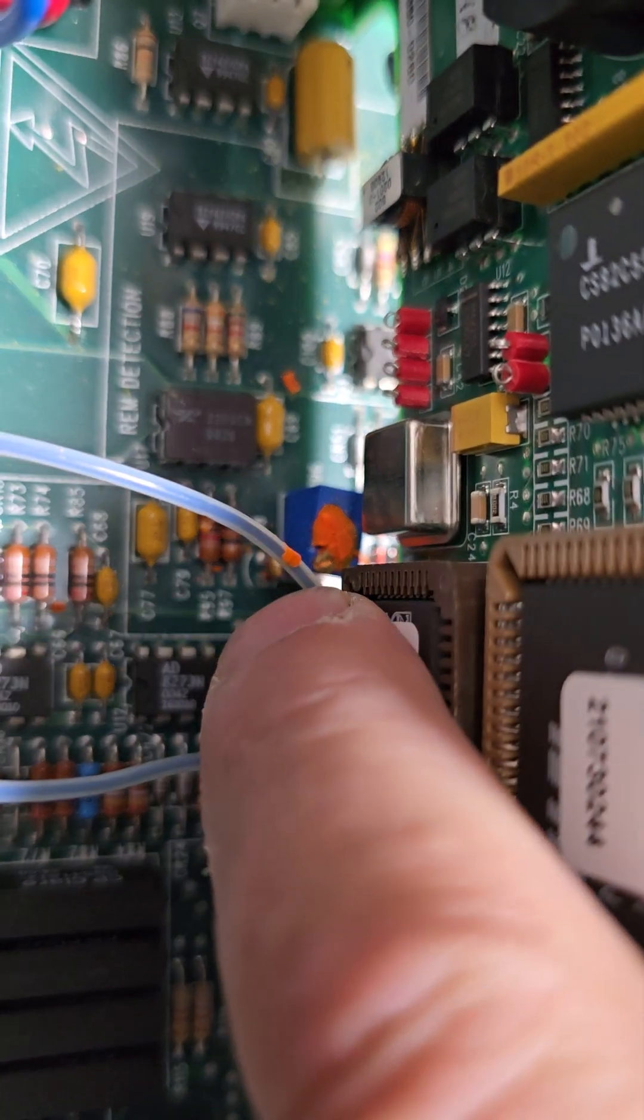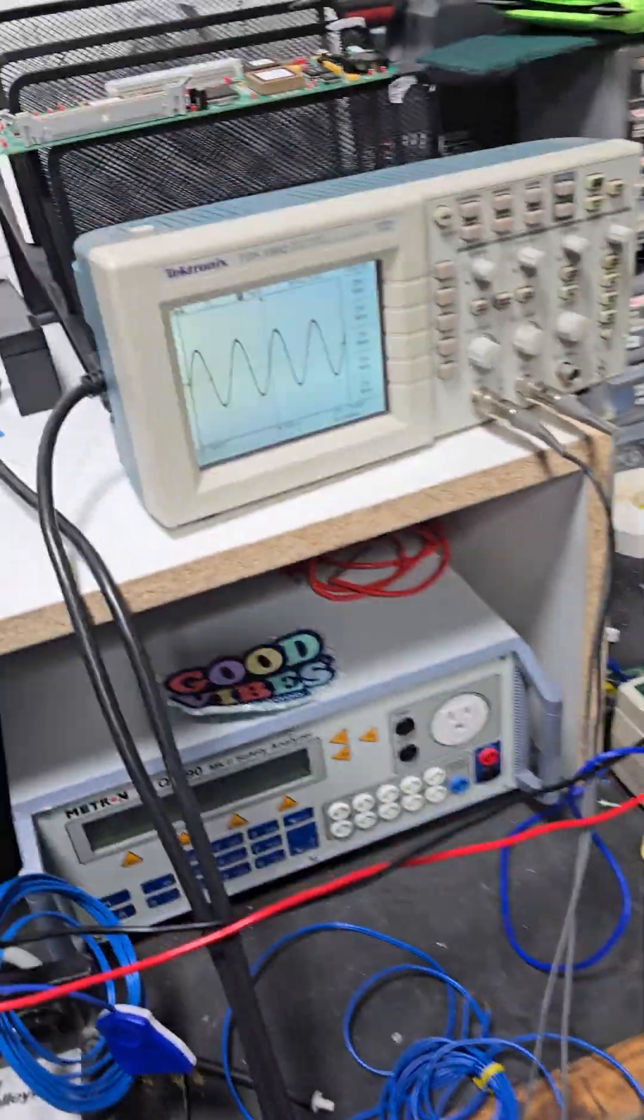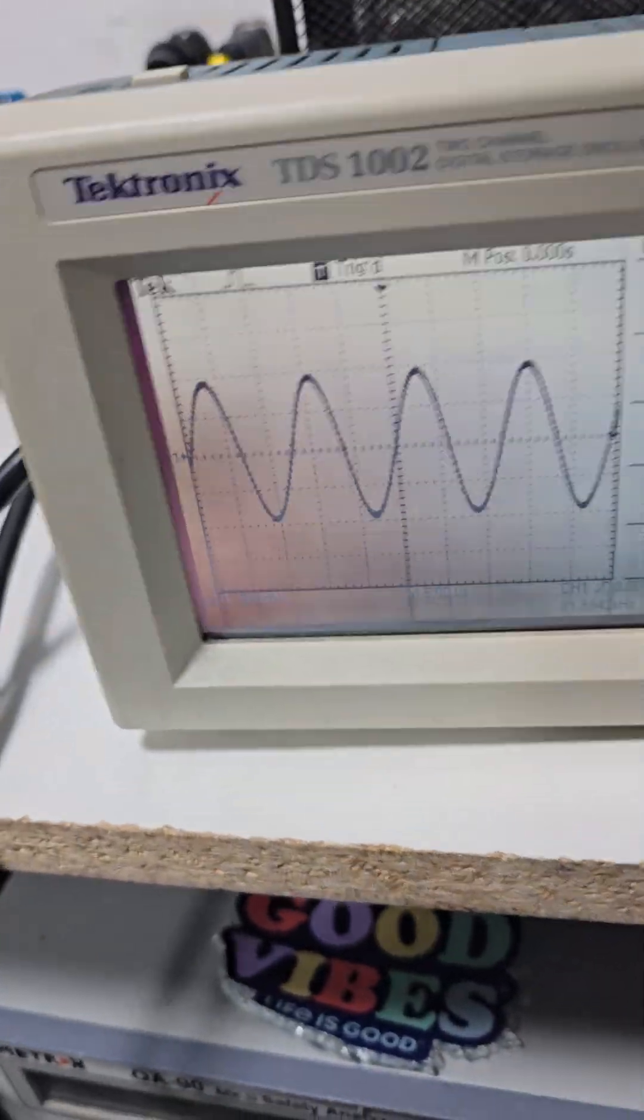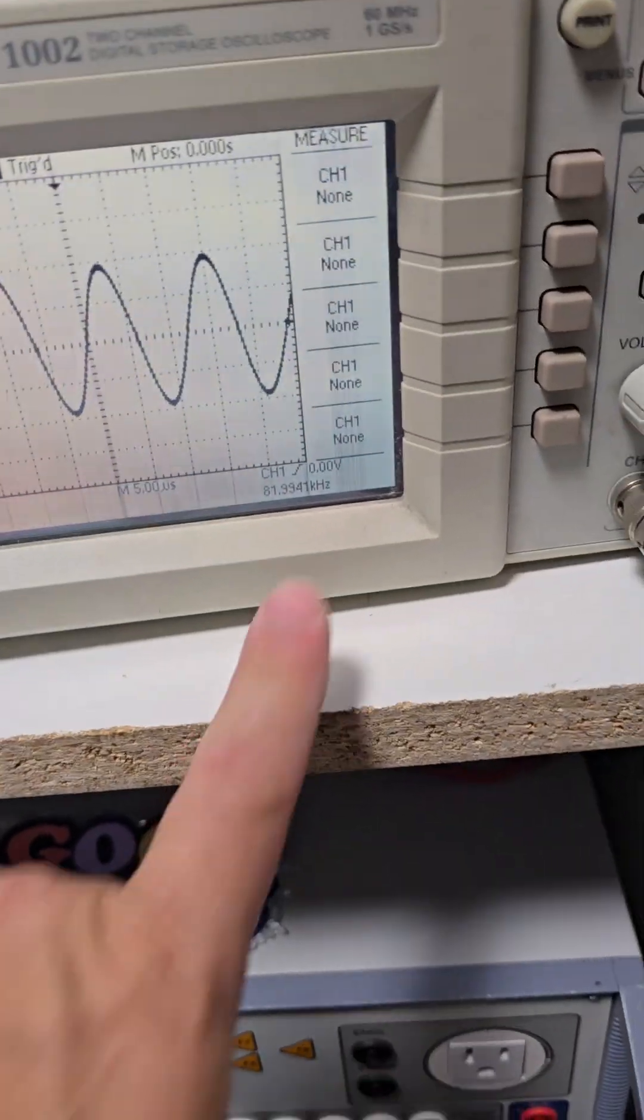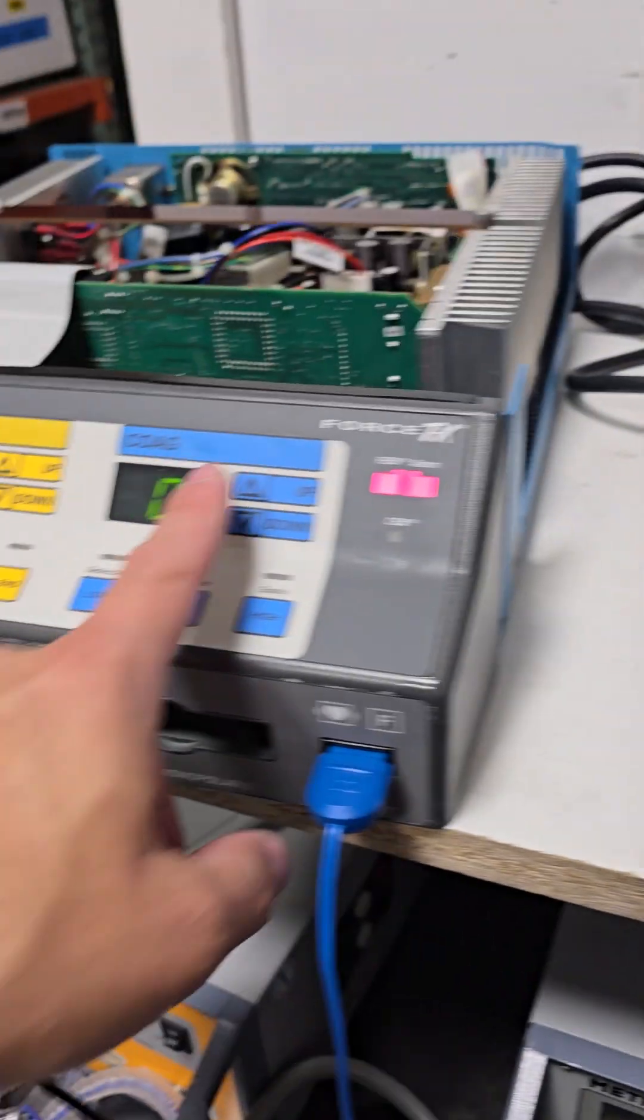You see this little screw right here, you just need a little eyeglass screwdriver to turn it. If you want to go up, turn counterclockwise. If you want your number to go down, it's clockwise. You adjust that until you get to 82 kilohertz or pretty darn close, and then you're good. And we move on to the next test.